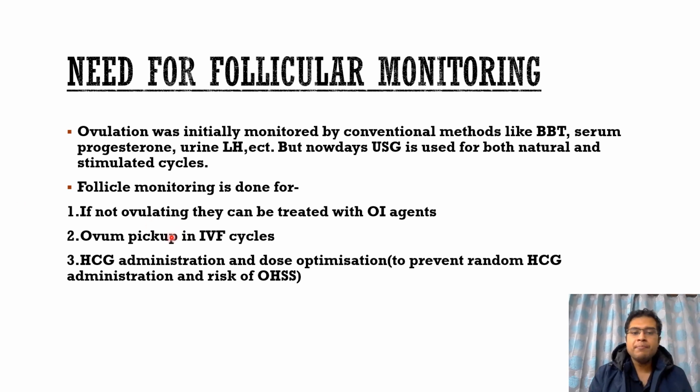Secondly, for ovum pickup, so we have to determine at what time the follicle is actually going to ovulate, so that we can time our pickup of ovum. And HCG administration and dose optimization to prevent random HCG administration and risk of ovarian hyperstimulation syndrome. So we'll see how it helps as we go further.